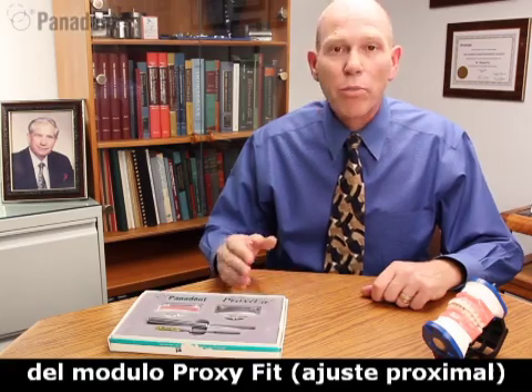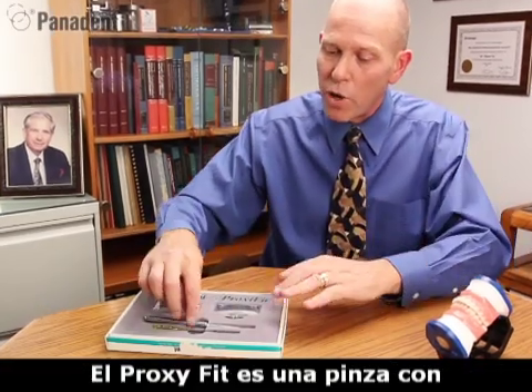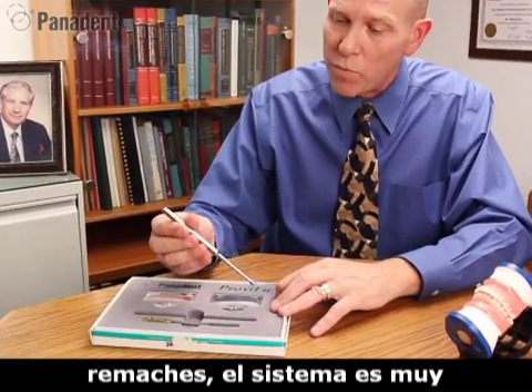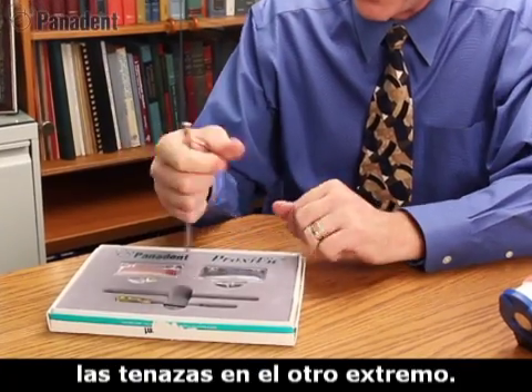Hello and welcome to my demonstration of the ProxyFit module and the multi-measuring ruler. The ProxyFit module is a ribbon forcep that works a lot like a ballpoint pen. We have a little button here on the end that we push, which will open up the jaws on the other end.